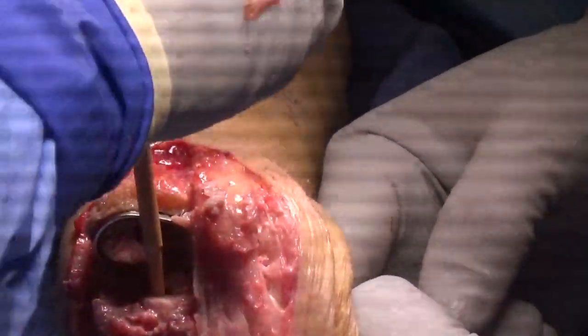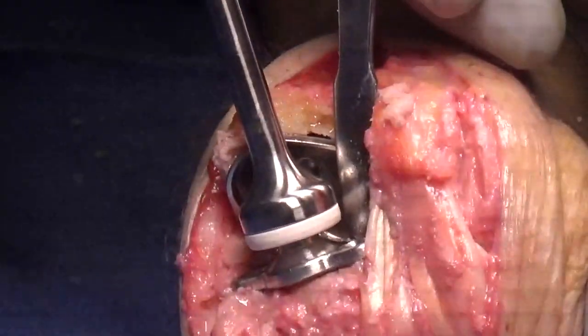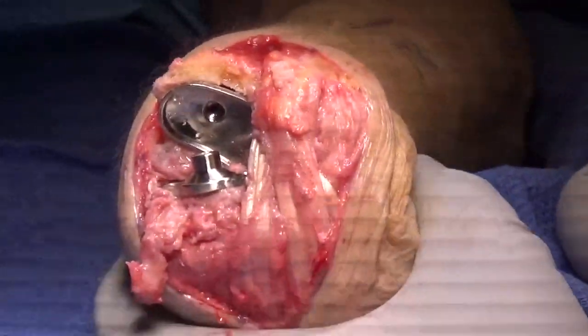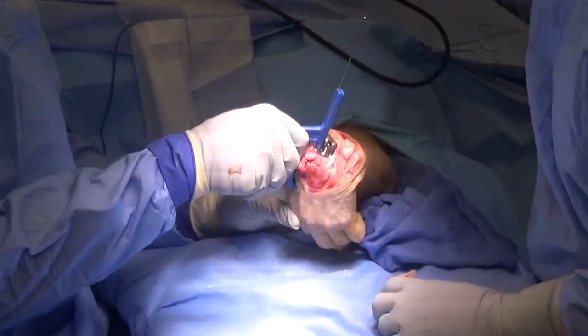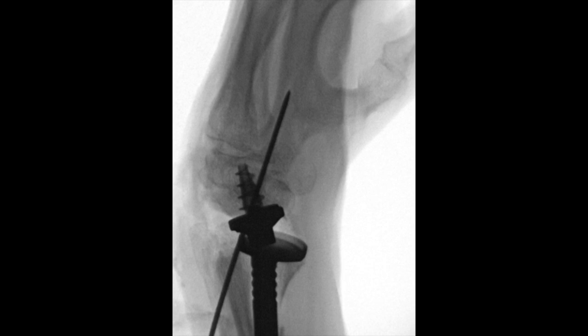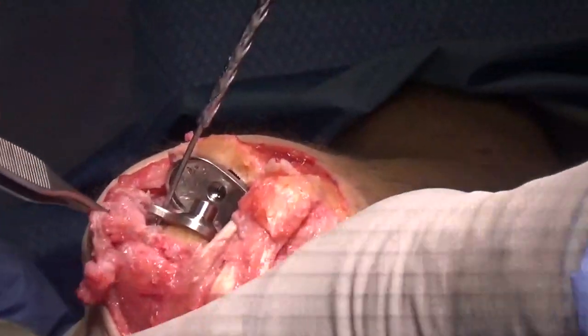Now we clean out our screw post. And the carpal plate is being inserted onto our central screw post. It's impacted into place with a Morse taper. And now with our drill guide, the index and hamate screws can be placed. Notice the congenital abnormality to the index metacarpal. We're still able to get a good screw placement into the index metacarpal.